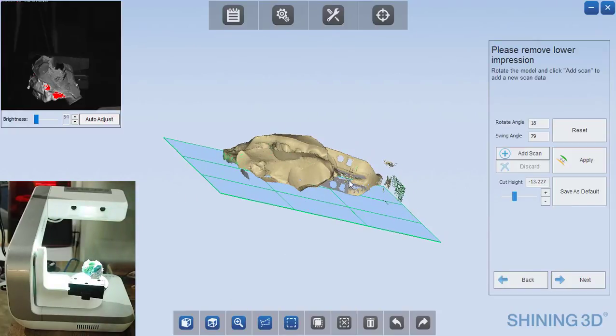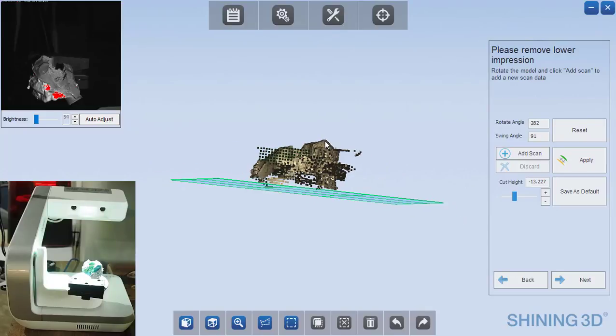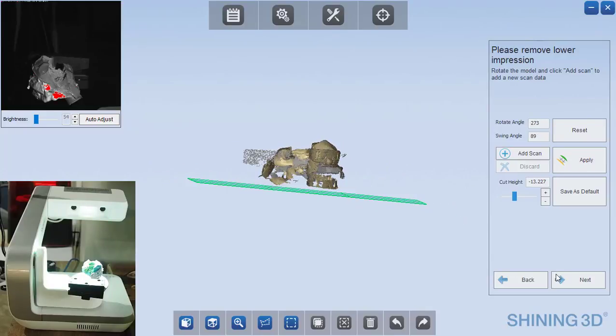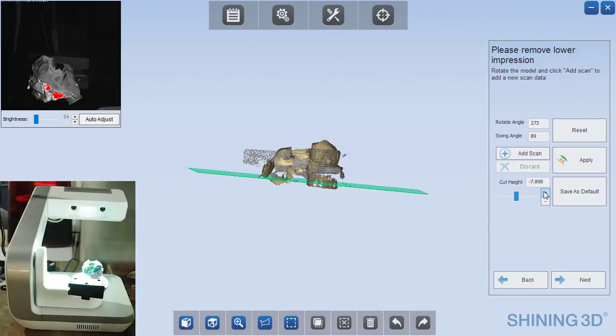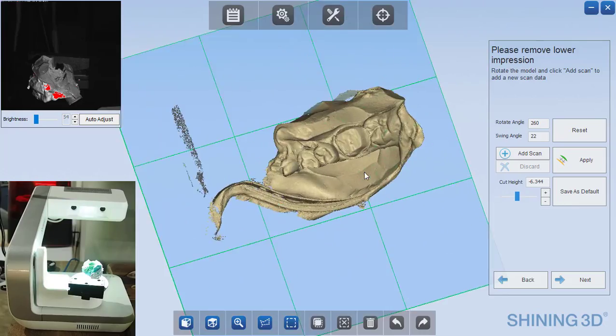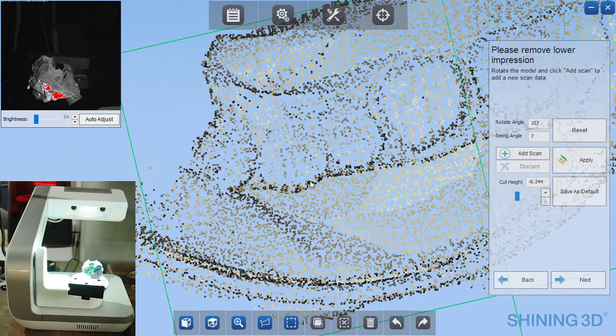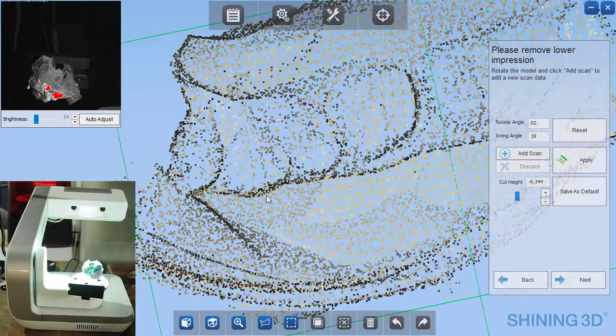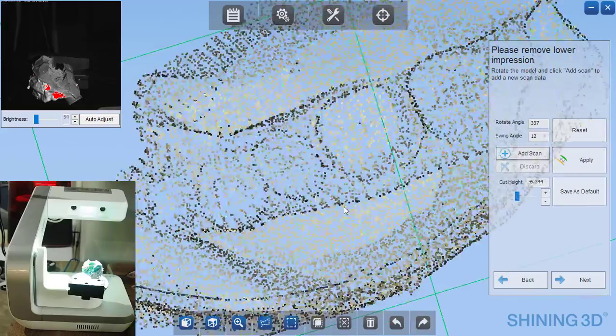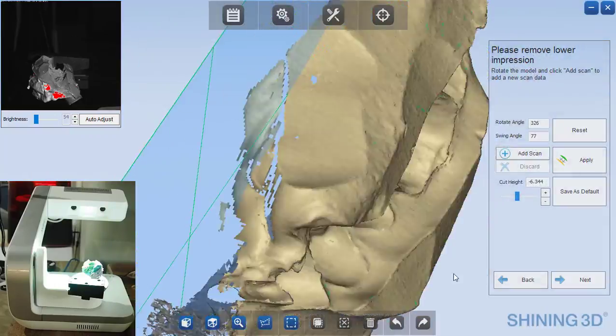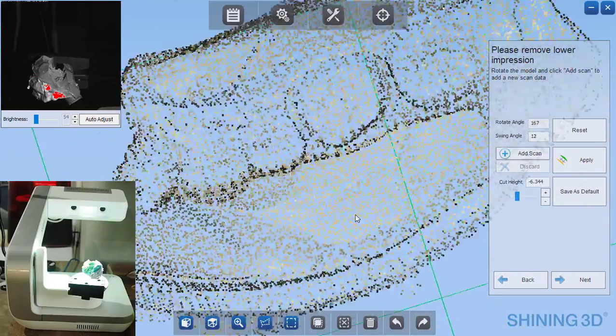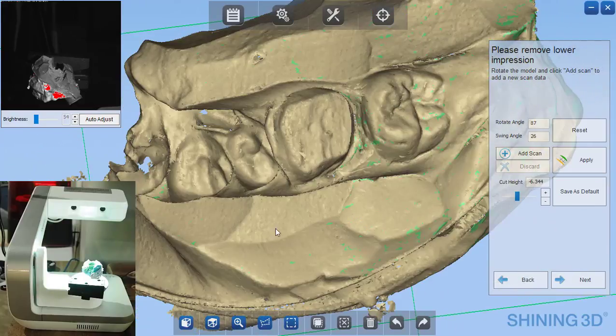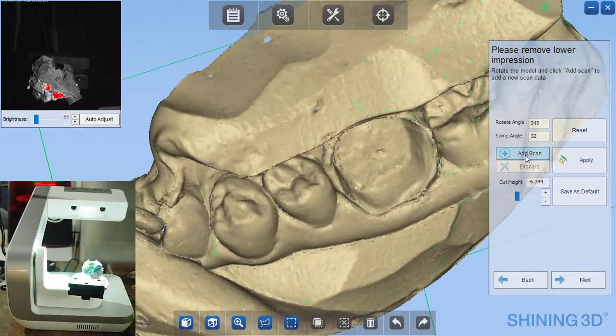Okay that's all done. So we could look at this and we could raise up the cut height if we wanted to, cut out some of the extraneous data, just make sure you don't cut off any cusp edges. And you also want to make sure, especially on your prep model, that you aren't cutting off any portions of the margins or the prep that it can see inside it everywhere and it appears that it does. If we needed to we could add scan data but this looks great.